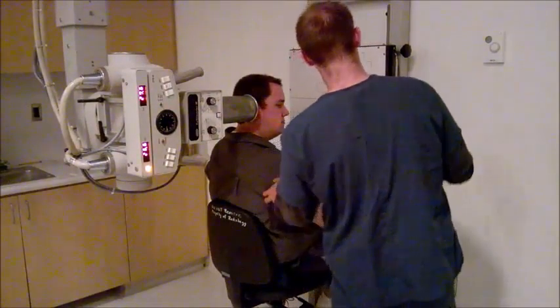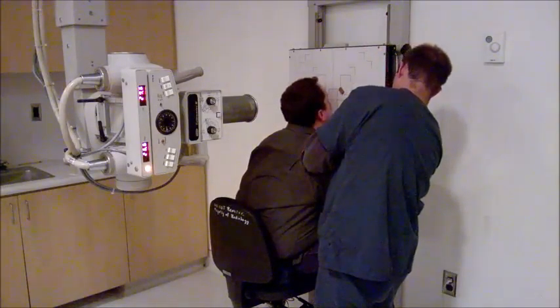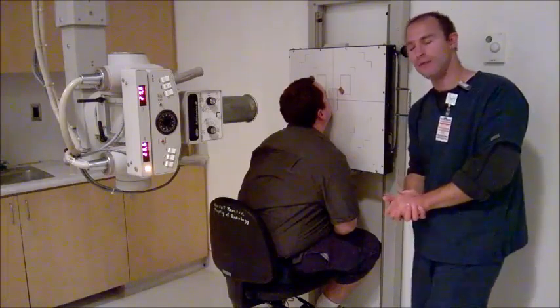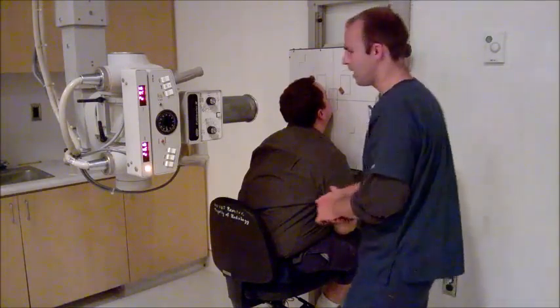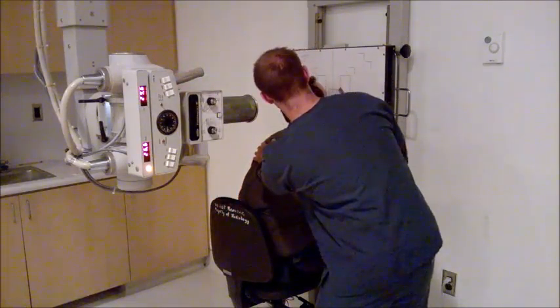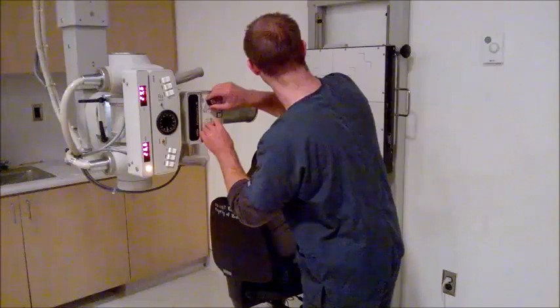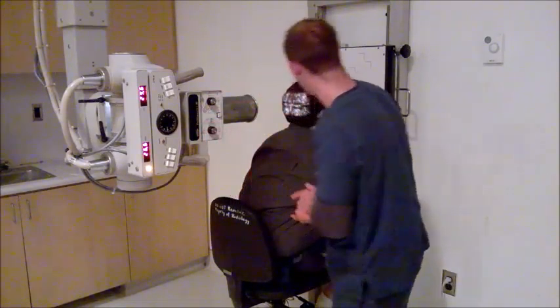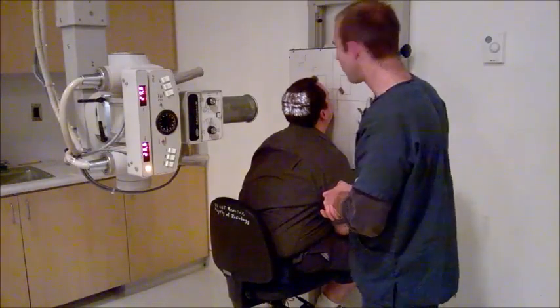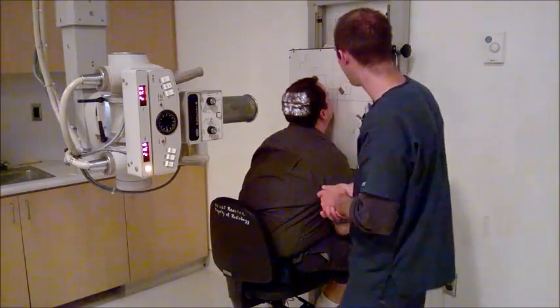All right, for this image, I'm going to have you put your chin way up. Yep, as far left as you can. So the point of this is to bring the IOML at 50 degrees to the IR. And let's see. Off to the right a little bit. There we go. Collimate to both sides. You want to get both sides just for the doctor to have a reference point. So to compare the two left and right sides of the orbits.